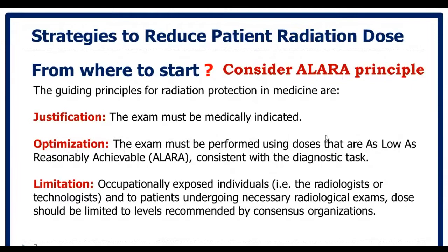Before using these machines in a real clinical environment, the quality control or quality assurance team needs to apply certain phantom imaging in order to calibrate the system and to specify radiation dose limits for each given procedure.